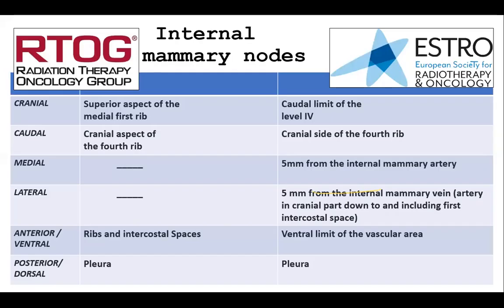Yes, sir. In the breast wall, there is not much significance. Even if we follow RTOG and ESTRO, it doesn't make much difference. The only difference is that skin is included in the RTOG, and a 5 mm margin is taken in the ESTRO guidelines. But the major difference will come when we contour post mastectomy patients.